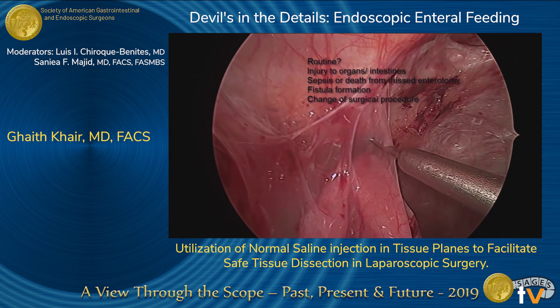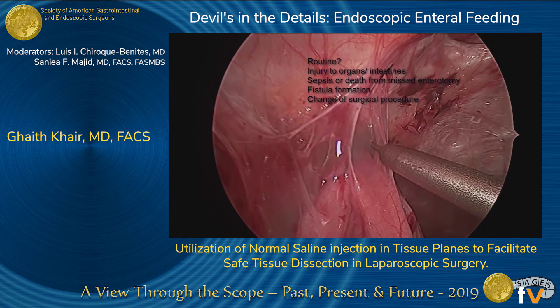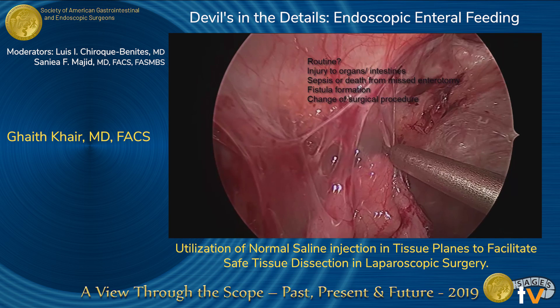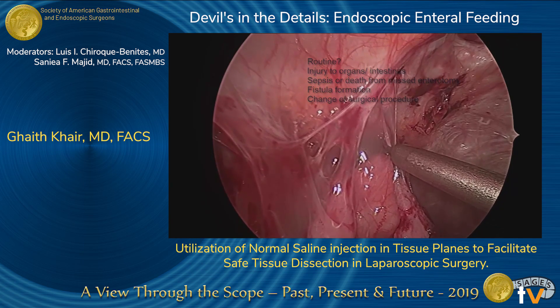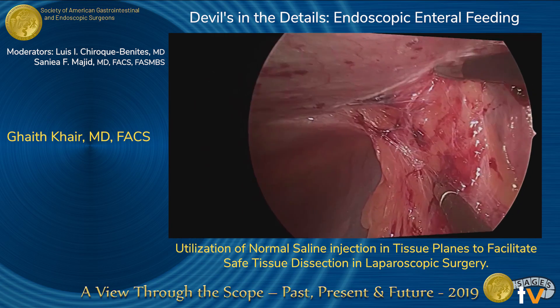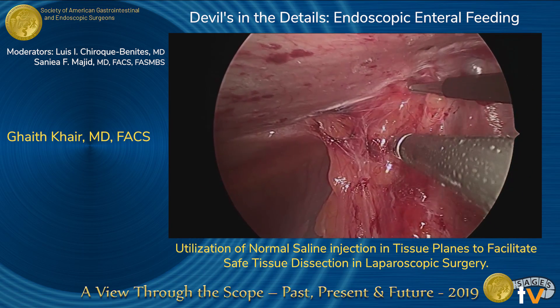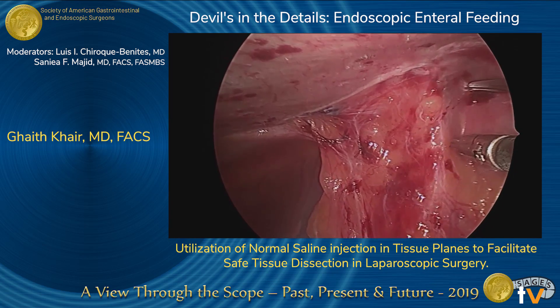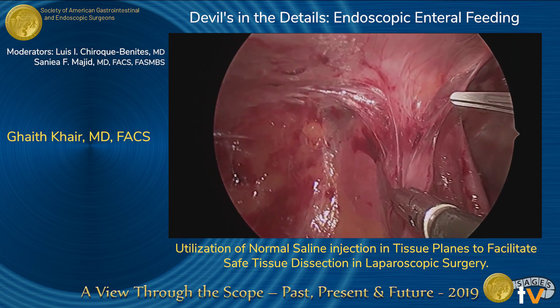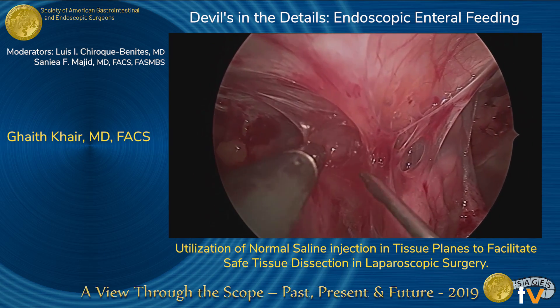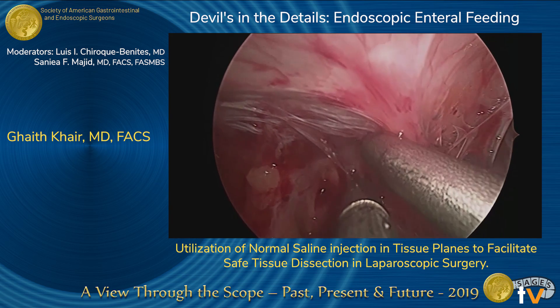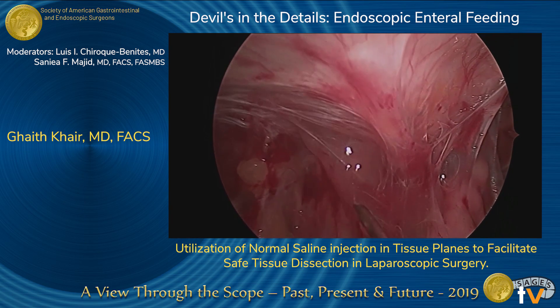And if we are doing laparoscopic incisional hernia repairs, it might mean we may not be able to use the mesh if we have made an enterotomy. The principles of dissection still remain the same: going from known to unknown, easy to difficult planes, and then clearly identifying one's anatomy before cutting through the tissue.